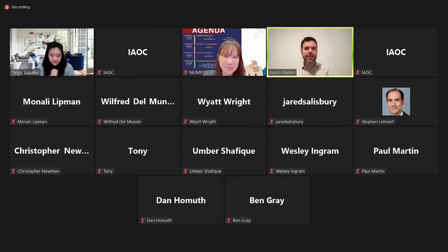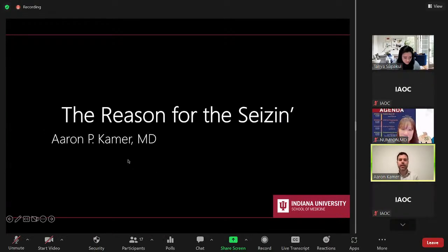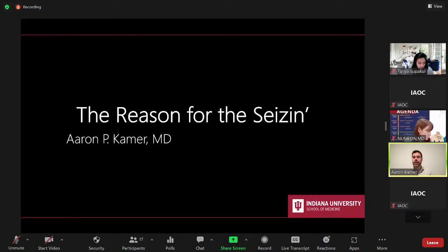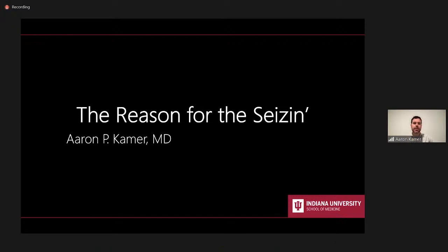All right, thank you, Tanya. Let me share. One of the things that I do regularly is participate as the radiologist in our epilepsy conferences, our multidisciplinary conferences. Early on, when I started doing that several years ago, I found that many of the findable abnormalities that patients have as a cause for epilepsy that do show up on MRI were actually not being detected by a lot of our radiologists, and a lot of the reason for that is that these abnormalities tend to be very subtle.